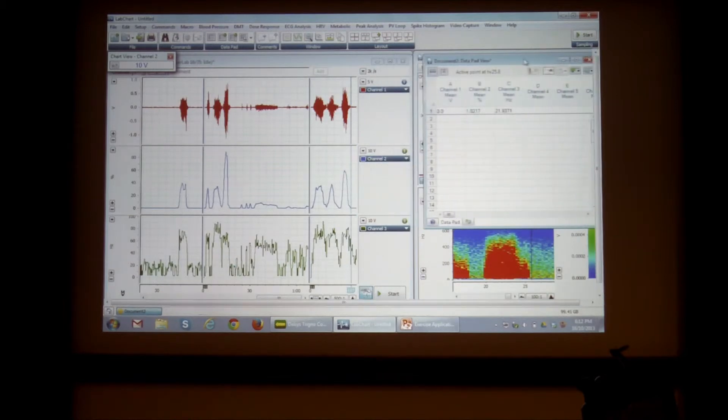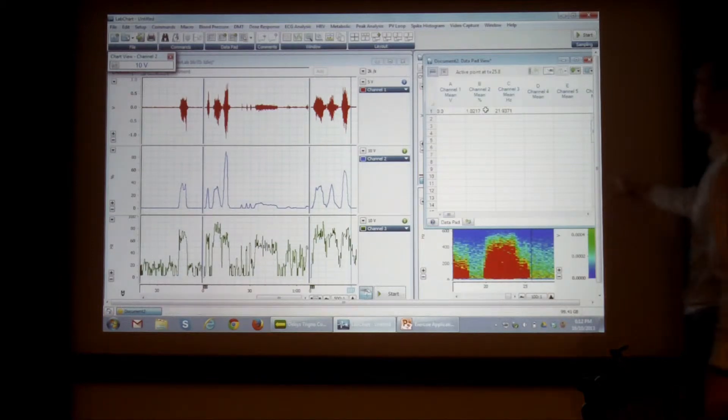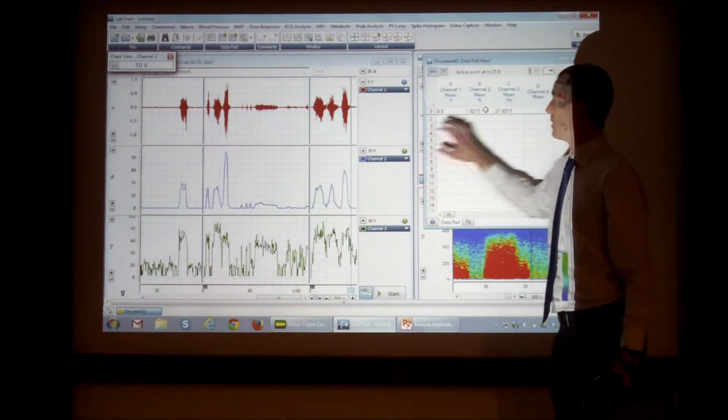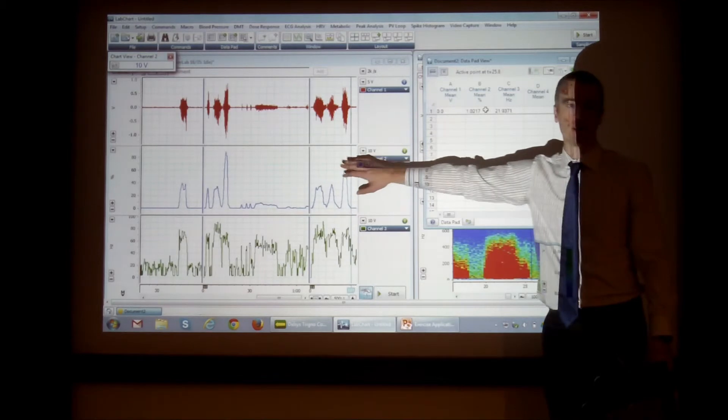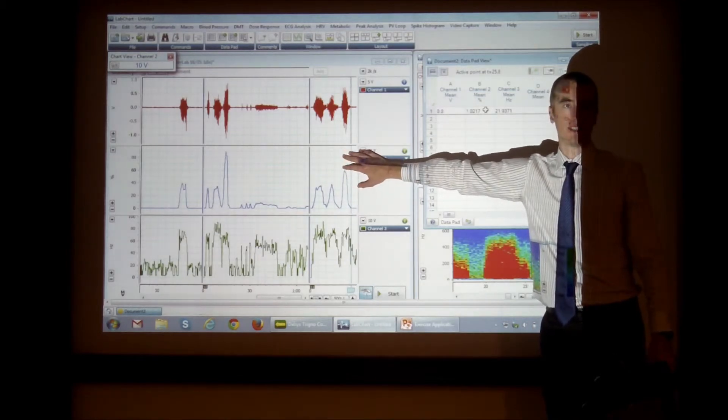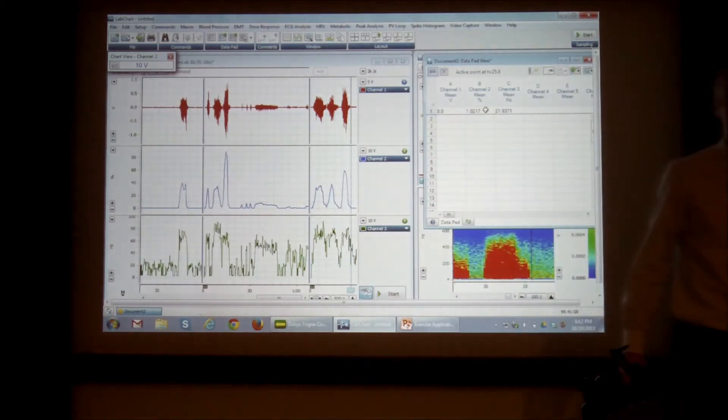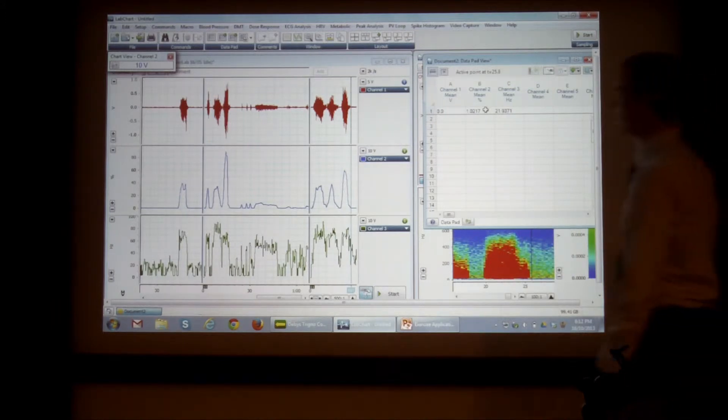So one thing you can do is use the data pad. So the data pad is like how you extract numerical data from the graphical data on this side.